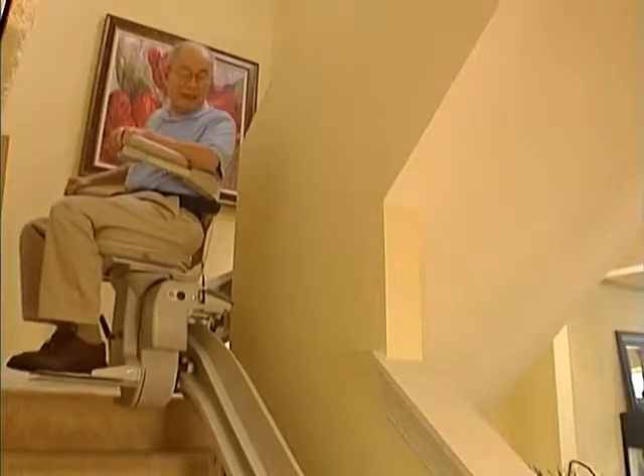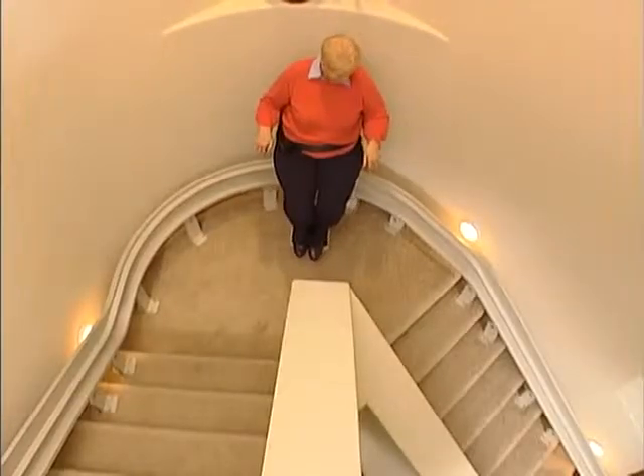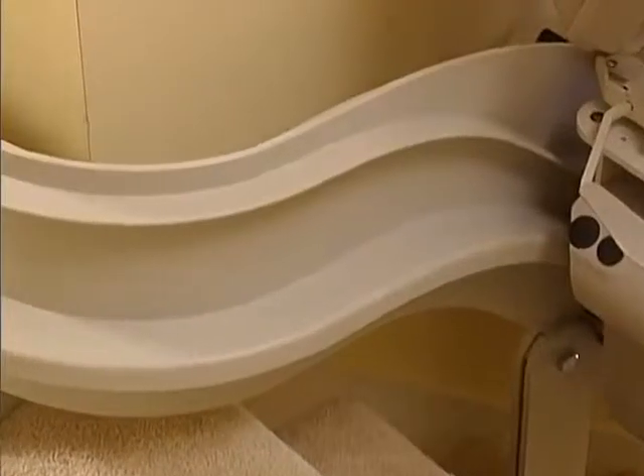But users will tell you, it's the ride — the steady, comfortable ride — that makes this stairlift so special. That, and the beauty of its styling.